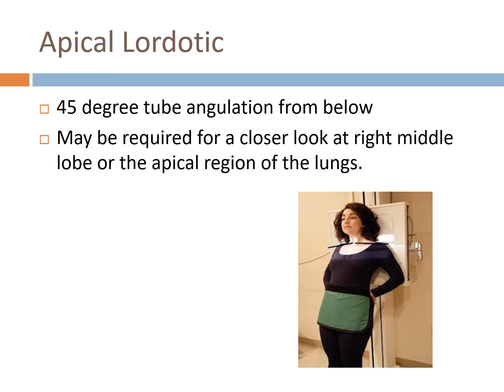So they have the patient tip towards the machine a little bit, giving a better view of the apices. And if you think of a type of disease that you would look for in the apices, TB. So anybody who's doing the TB presentation, I can't remember off the top of my head, but that might be a good thing to add to your clinical sim: ordering an apical lordotic view of a chest X-ray. That might make you start thinking, so I think that'd be a really good idea to include.